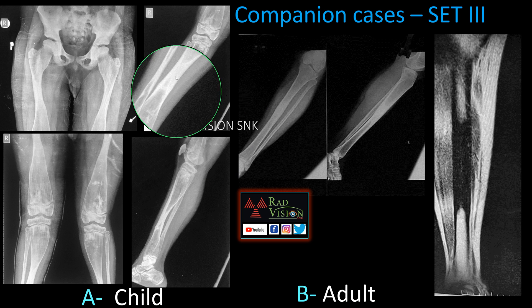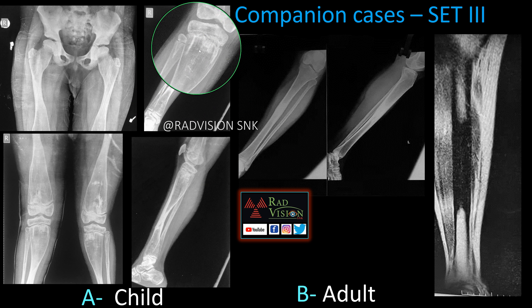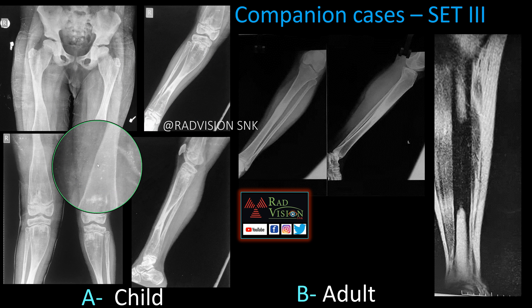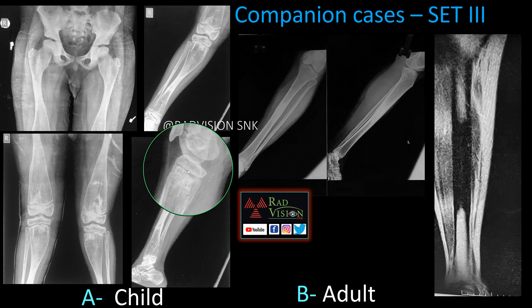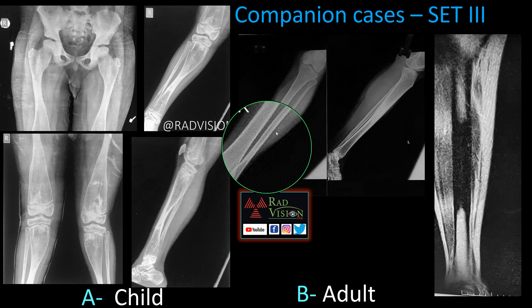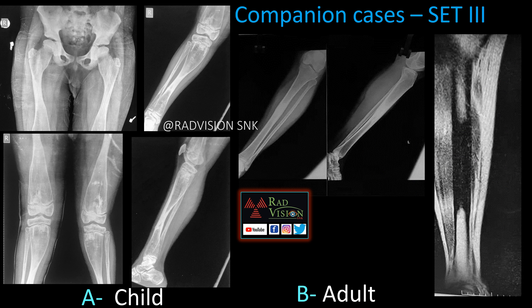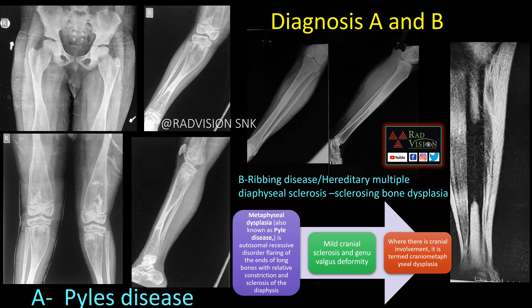Next case shows Erlenmeyer flask deformity with metaphyseal sclerotic bands and mid-diaphyseal sclerosis involving the tibia and femur — all long bones showing mid-diaphyseal sclerosis with Erlenmeyer flask deformity. This is Pyle's disease, also called metaphyseal dysplasia, with flaring of long bone ends, Erlenmeyer flask deformity, mid-diaphyseal sclerosis, sometimes cranial sclerosis and genu valgum. The adult case with mid-diaphyseal sclerosis that is hypointense on MRI is Ribbing's disease, also called hereditary multiple diaphyseal sclerosis.